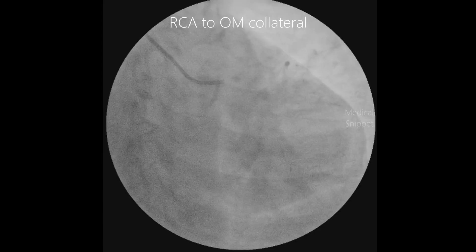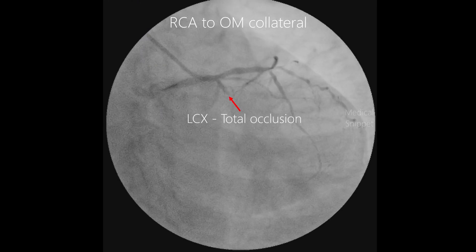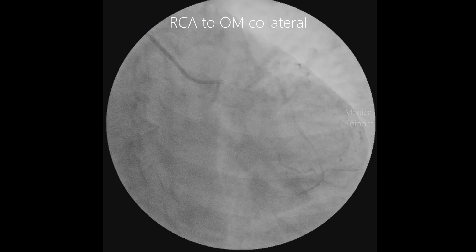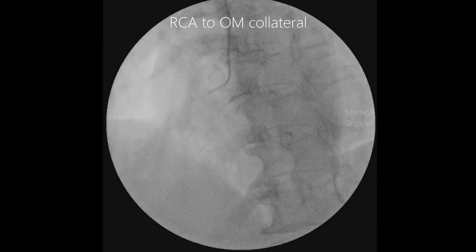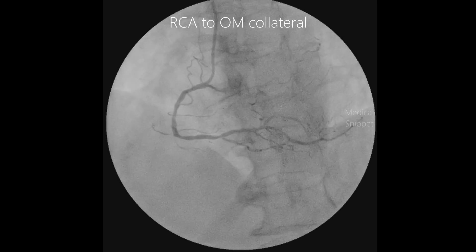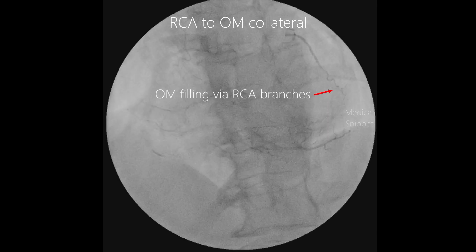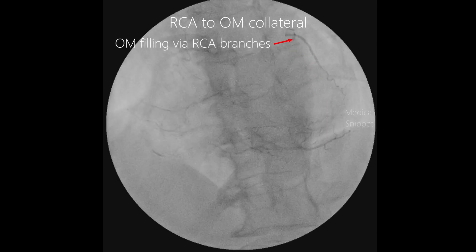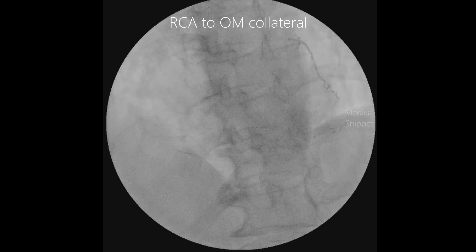The second case shows collateral from the RCA to the obtuse marginal branch of the left circumflex artery. In this angio shot, there is total occlusion of the left circumflex artery, and the obtuse marginal branch is being filled from the right coronary artery branches.